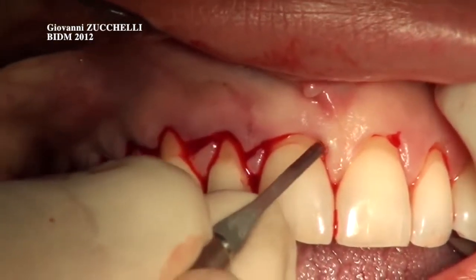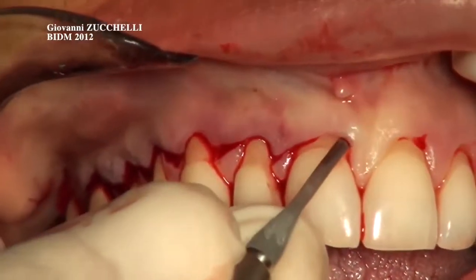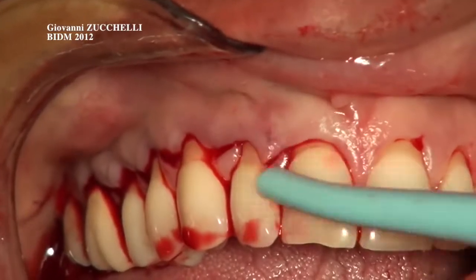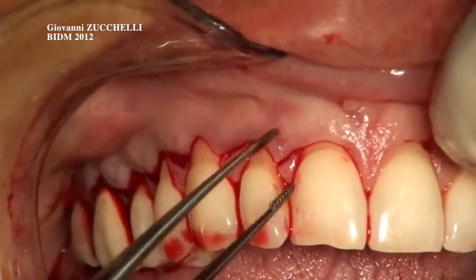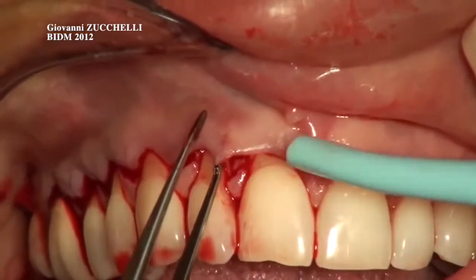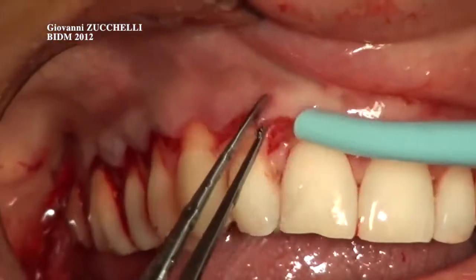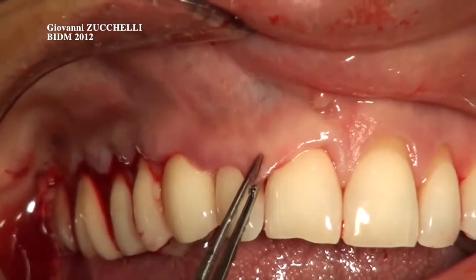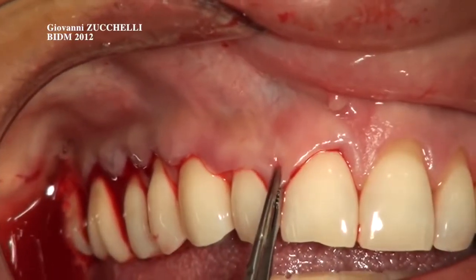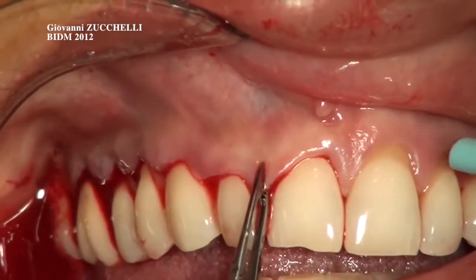Now that the deep incision has been done, I'm tunnelizing the interincisor papilla and making the superficial incision. In such a way, you have to see if the surgical papilla starts to passively move. Saline please. Very nice. So you can see now that thanks to this movement of the soft tissue, the entire central incisors can be covered with no bend of the soft tissue, and you can also cover it in excess.